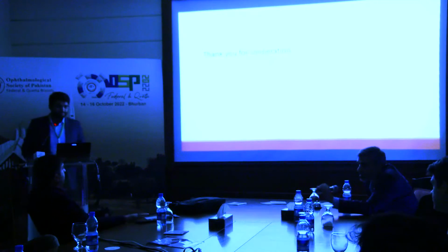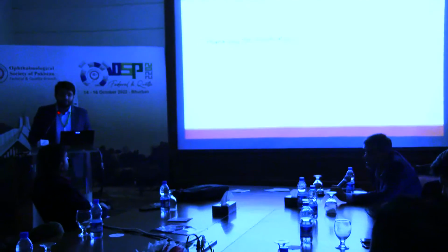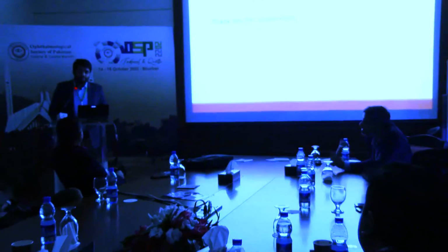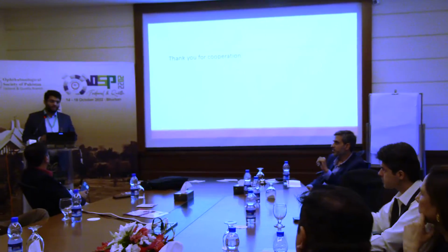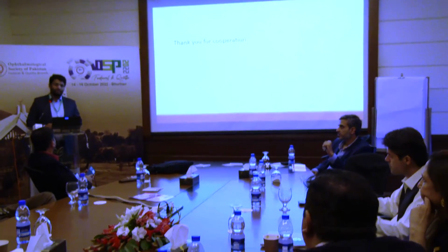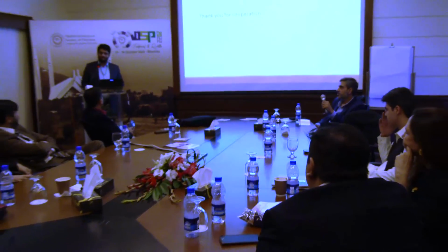Any questions? Do you use any post-processing for these images? Yes, sir. Post-processing, I mean, do you put them in some software? No, I use the originals, because the colors and the original retina picture would be slightly affected. Therefore, I personally use the original pictures.